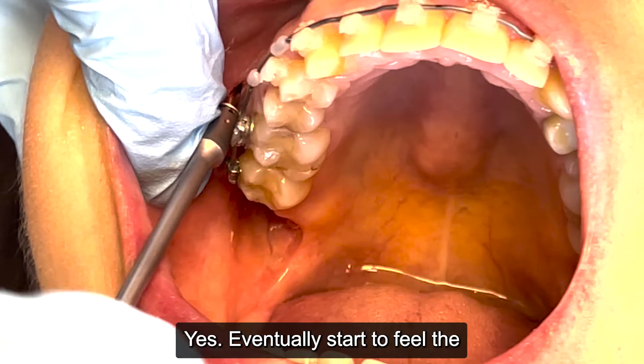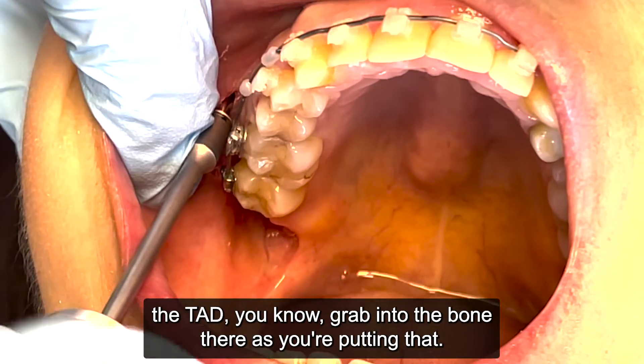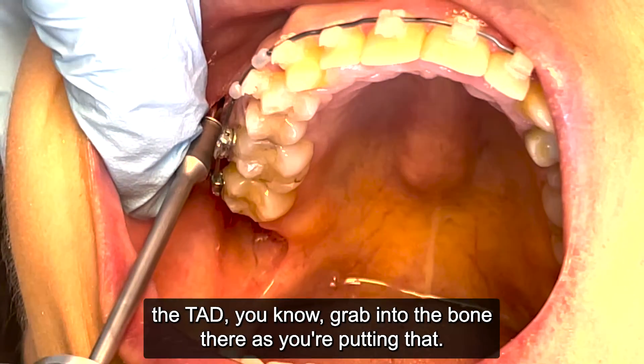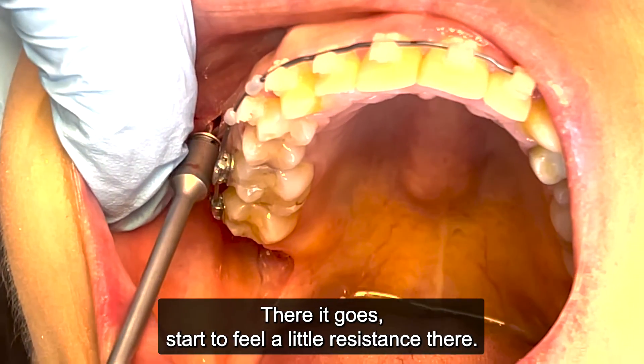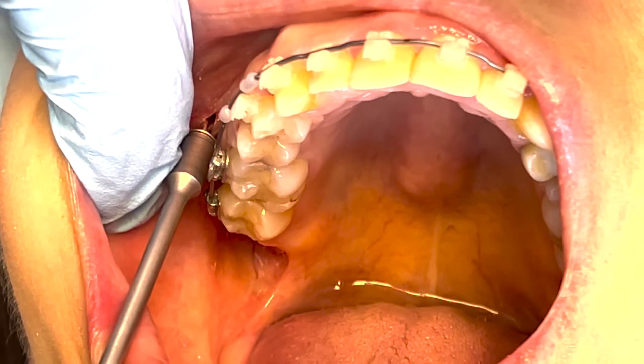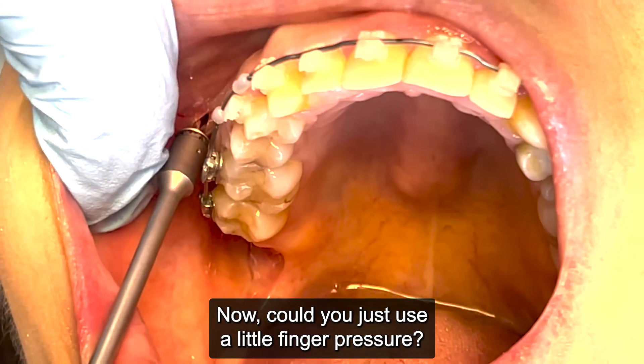We eventually start to feel the TAD grab into the bone as we're putting it in — there it goes, starting to feel a little resistance. Now I can just use a little finger pressure.